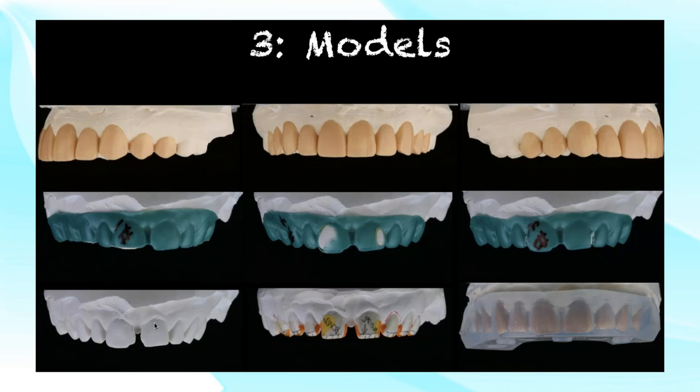So the material is going to be whatever it is that you choose, whether it's Cerinate, whether it's lithium disilicate, whatever it is that you choose. But the shape, the form, the texture is going to be similar to what you're going to be able to deliver them that same day.